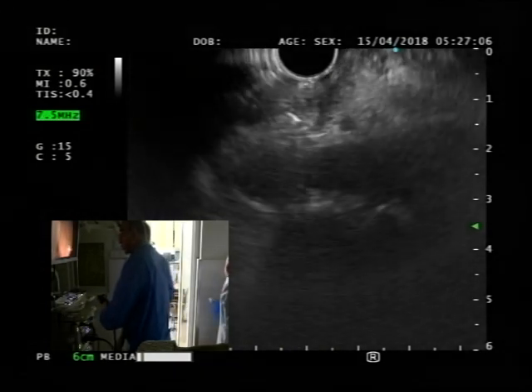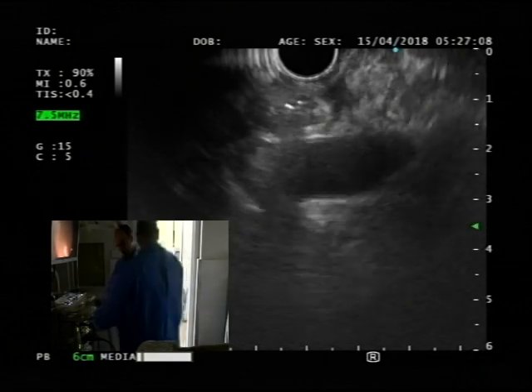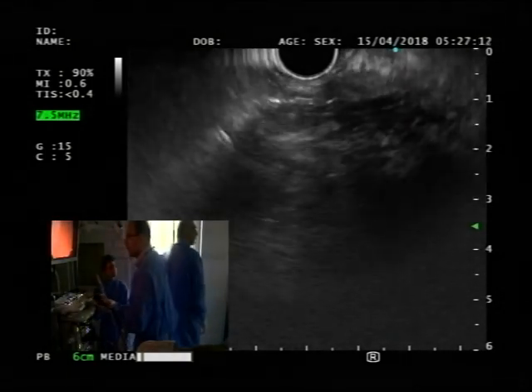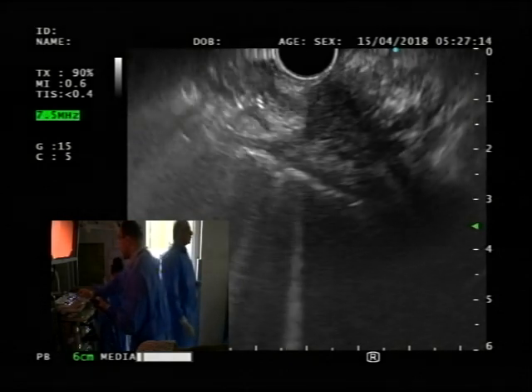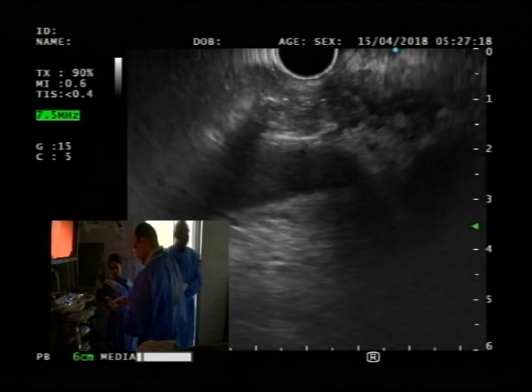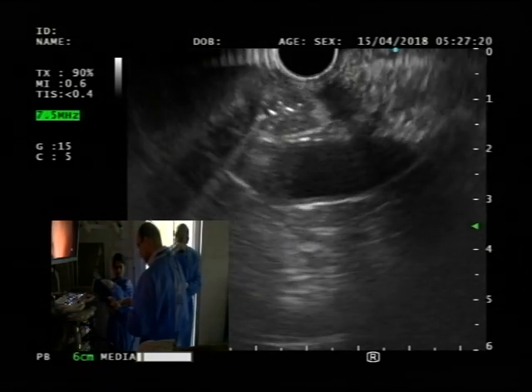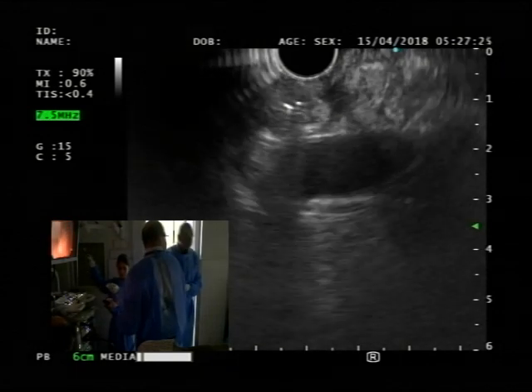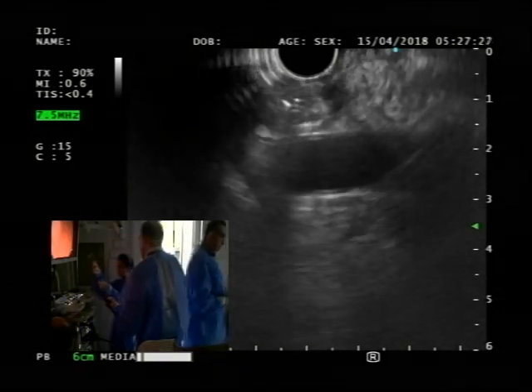So then let me take over. Let's do one more, okay, so we can move on with our cases. There was nothing. Yes, that's what I heard. What about this? And then how about this one? Okay, I'll just do another one anyway.